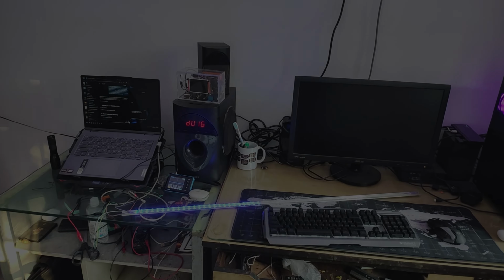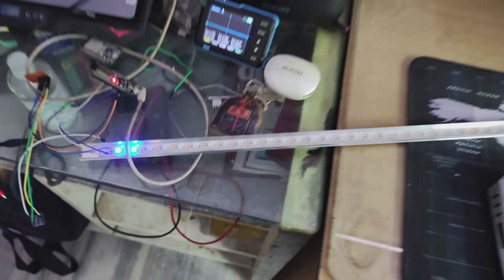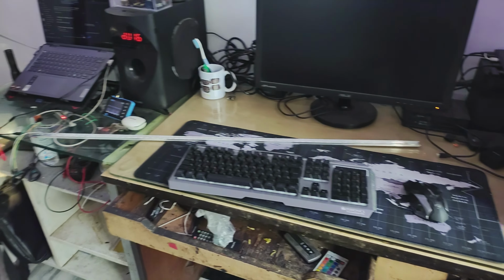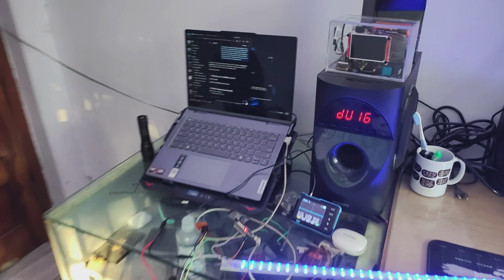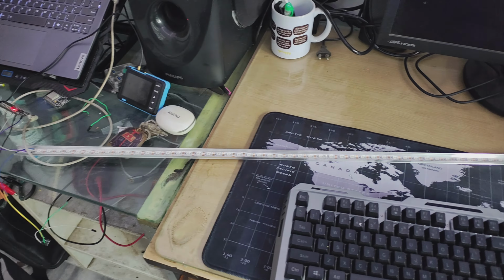I thought you might want to take a sneak peek of how I built this EMDR device from scratch. It took many weeks of experimentation and polishing this device to perfection. Especially the edge slowdown, the light slowing down at the edges in a sine and arc sine wave, that took many days of experimentation.